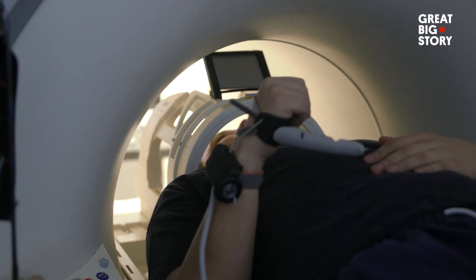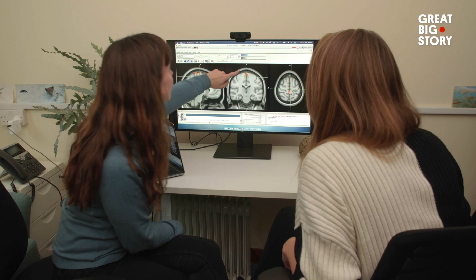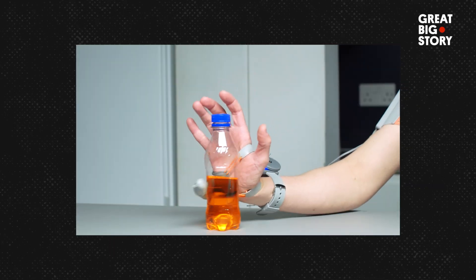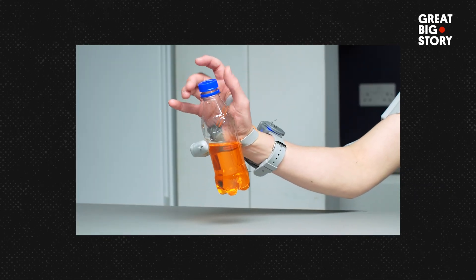It's not claustrophobic at all in here. My name is Tamar Makin and I'm a professor of cognitive neuroscience, running the Plasticity Lab at Cambridge University. I got a grant to start establishing the first frontiers of human augmentation — specifically allowing people to have extra body parts. A colleague told me about a video of this extra robotic thumb, so I asked my student to hunt down Dani Clode, and that's how we started working together.